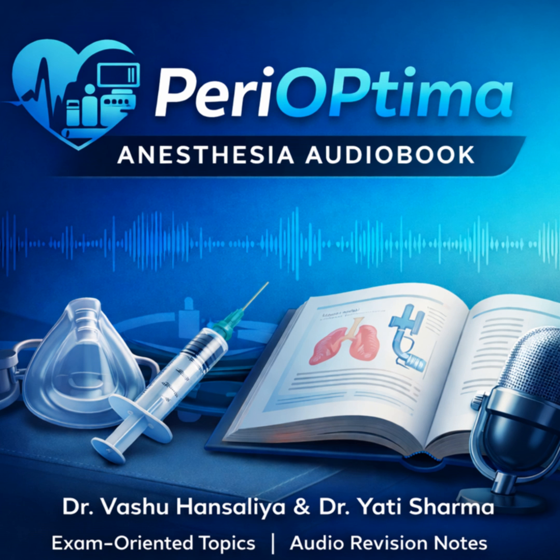That's its lane, exactly. We should also briefly mention the other first-gen devices just for completeness. The LMA Unique is simply the single-use, disposable sibling of the classic LMA. It's a cost-effective choice for hospitals. And then there's the flexible LMA, which is essential for specific surgical fields. Its tube is wire-reinforced, so it's kink-resistant, it's longer, and it has a smaller diameter. This allows the airway tube to be positioned away from the head and neck surgical field, though that design does make it structurally unsuitable for intubation.